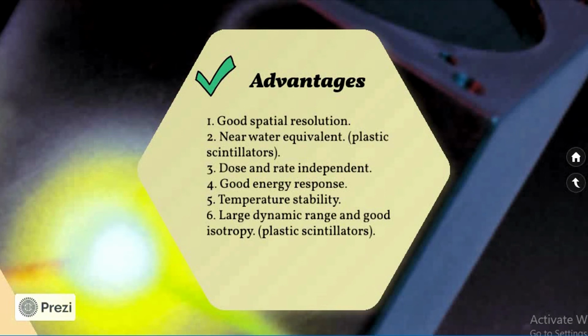Also, they are independent of dose rate and can be used from 10 mGy per minute to about 10 Gy per minute used in external beam dosimetry.